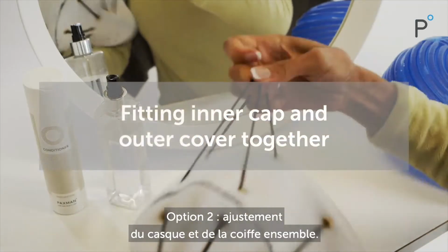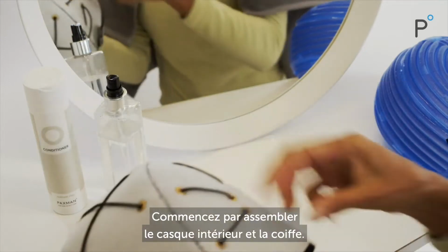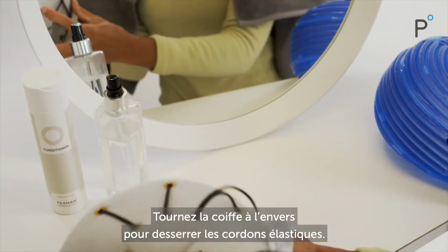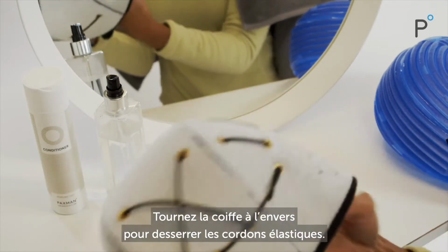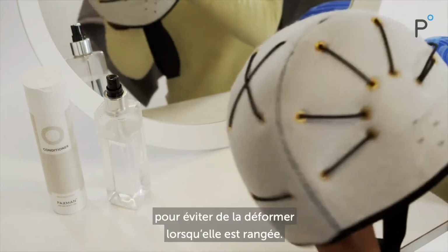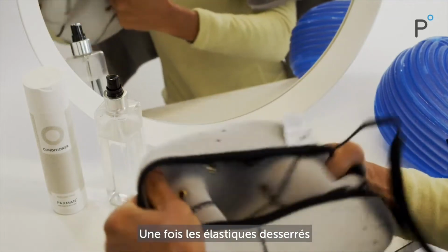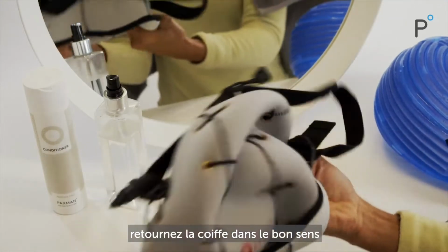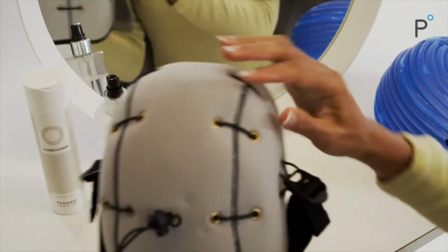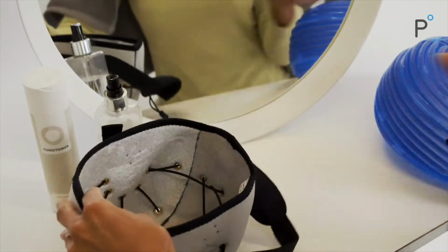Option 2. Inner and outer fitted together. Start by assembling the inner cap and outer cap cover. Turn the cap cover inside out to loosen the bungee cords. This should be done every time the cap is removed to avoid the cap distorting during storage. Once the cords have been loosened, turn the cap cover the right way out and make sure that the chin strap is loosened. Place the cap upside down so that it is resting on the crown.